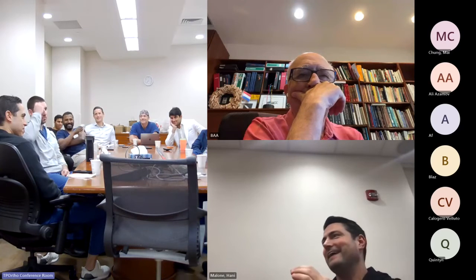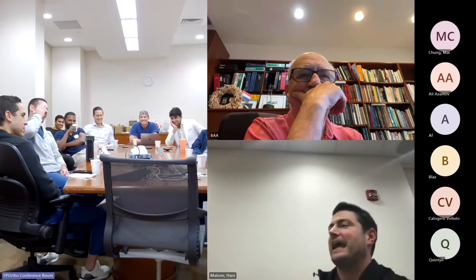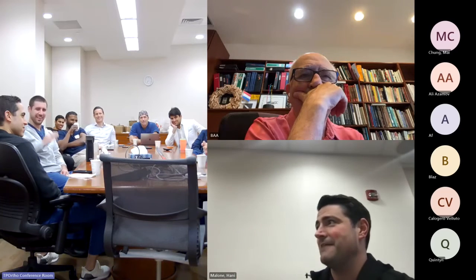And then I shoot in a little DBM putty to create a little barrier. Then I put in the graft, and sometimes I'll put a little sponge in the graft. And then I backfill with DBM fibers, and then I kind of seal, like spackle it, at the back of the disc space, so I feel like there's a barrier.